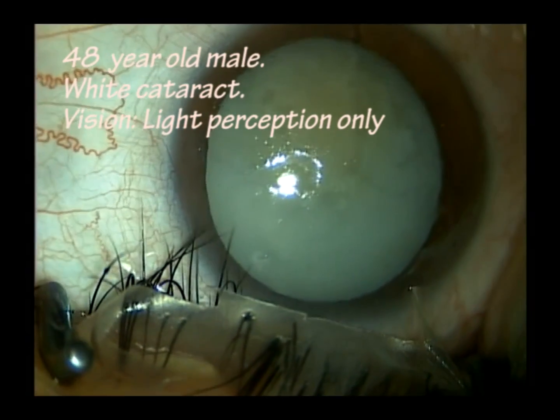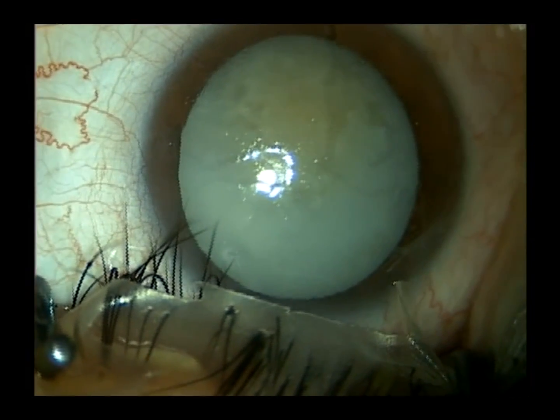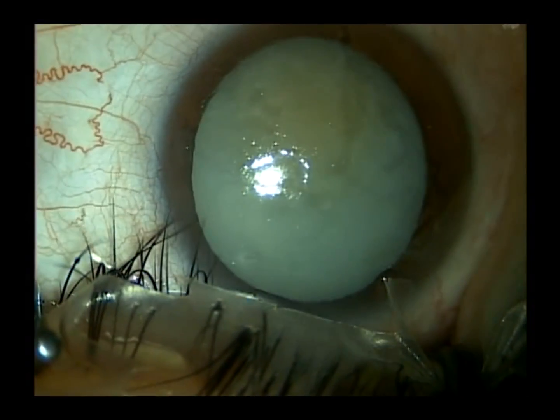This is an example of how we deal with white cataracts. This is a 48-year-old gentleman who has light perception vision. White cataracts have unclear etiology.